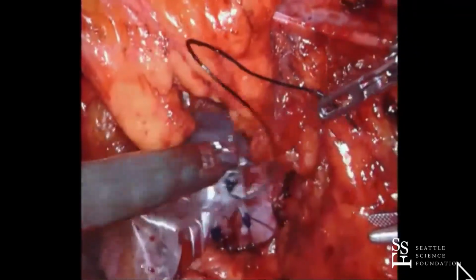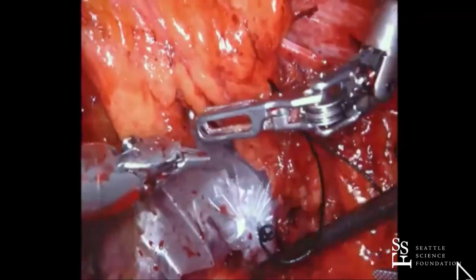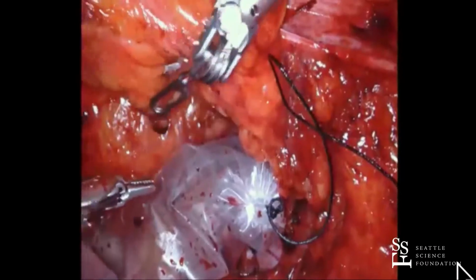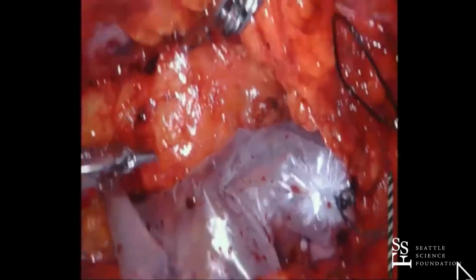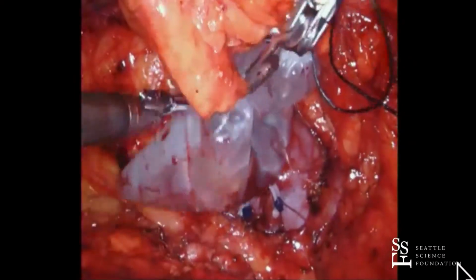All right, what we're going to do is I am going to put a drain in. I put them in retroperitoneal. I don't always put them in trans, but it's a small space, and sometimes they just get ecchymosis. It's just blood that pools in there, but we found the drain just kind of gets rid of that, so people ask fewer questions about what's going on with my side.